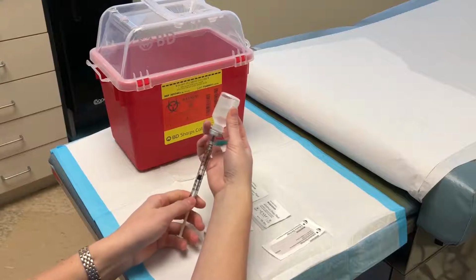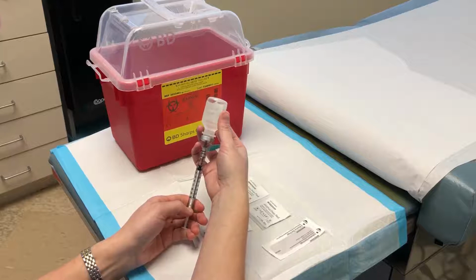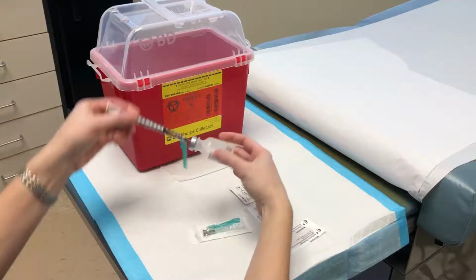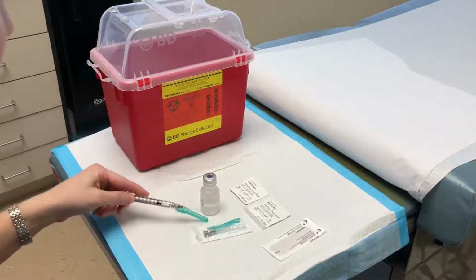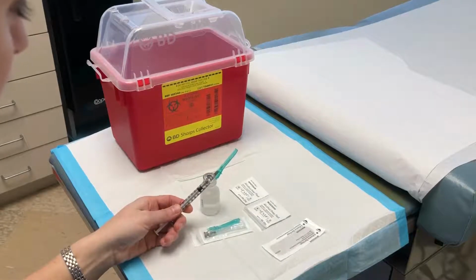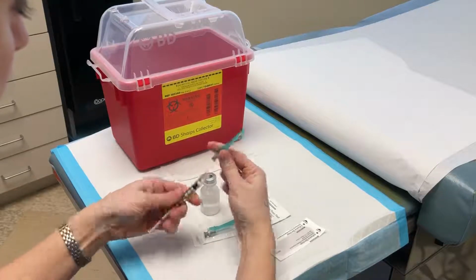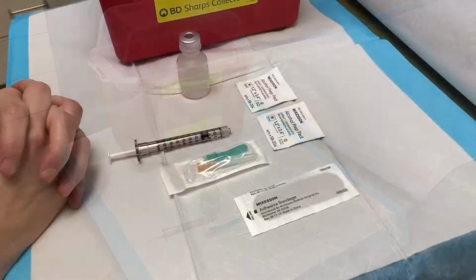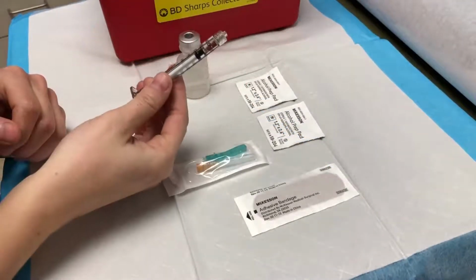Then push your plunger to your medication line, ensuring that all air goes out of your syringe. Turn the vial right side up, pull the needle straight out, and cap your needle using a flat surface. Do not use any part of your body to close the needle. Then, twisting from the base, remove your needle, and immediately dispose in your sharps bin. As long as you don't push the plunger down, your medication will not spill out of the syringe.